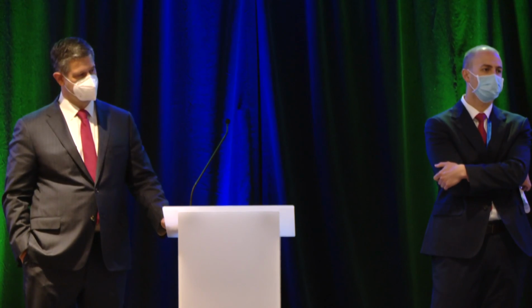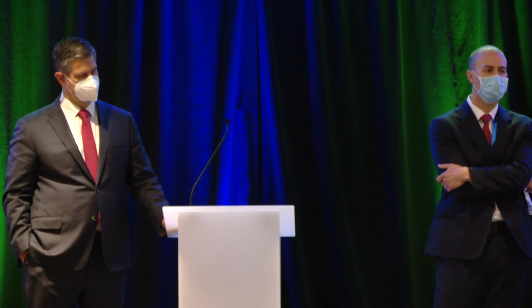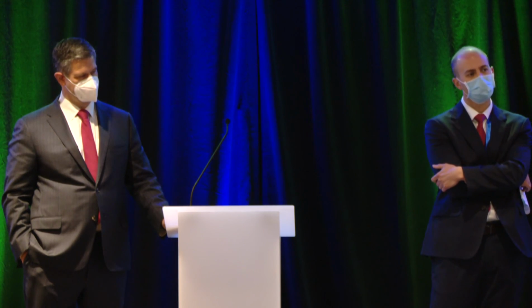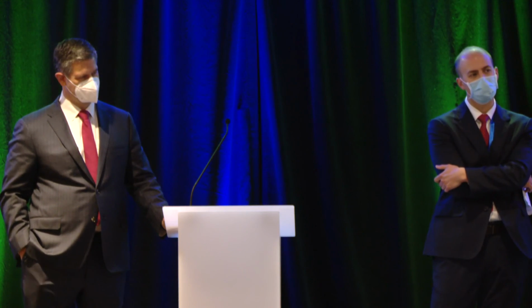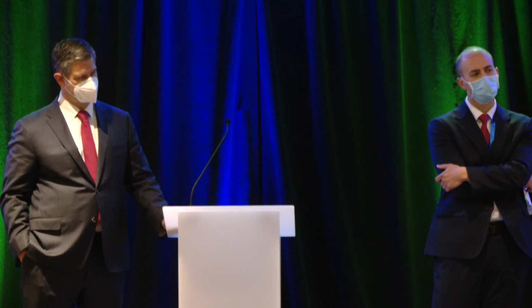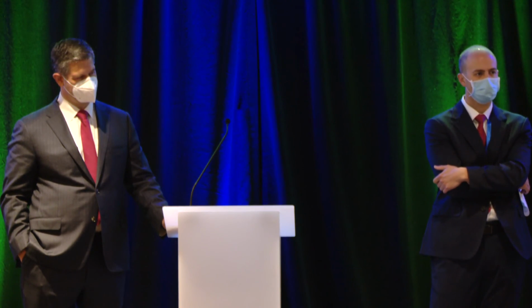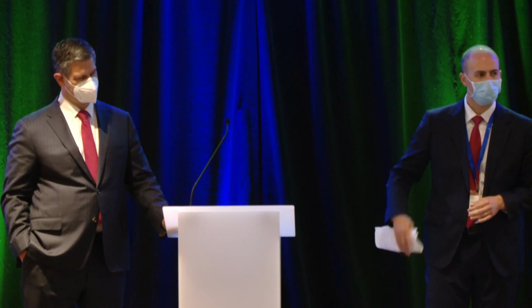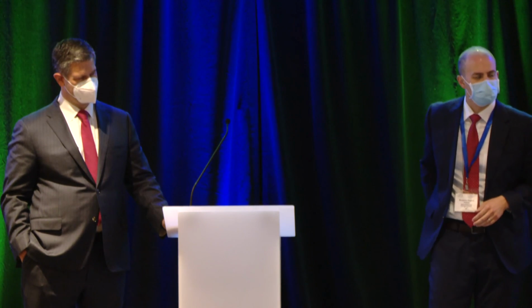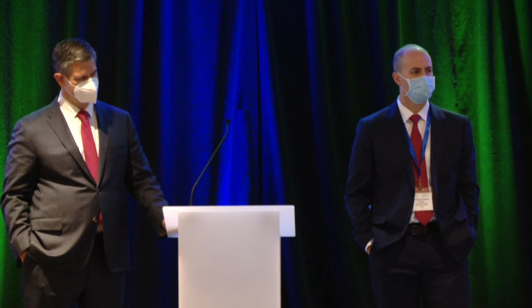In that case, there are a couple of surrogate markers for obstruction. What you're really trying to rule out is obstruction. One is pressurization. If you see pressurization between the contraction front and the level of the LES, that should give you pause, and you need to get an upright barium or some other evaluation to make sure that there is no true obstruction. It might just mean that the esophagogastric junction is not straight, it is a little kinked. Sometimes you can sort that out by sitting the patient up. But if it's a large hernia, I wouldn't worry too much about where your gastric baseline is, because the hiatus is likely very open, and you'll have a decent representation of gastric pressure within the hernia.